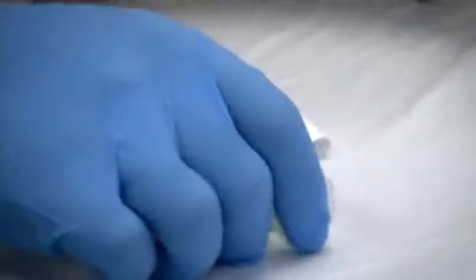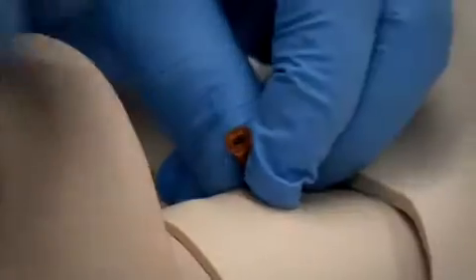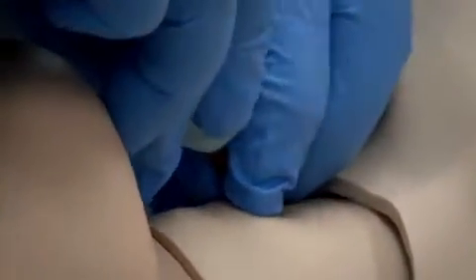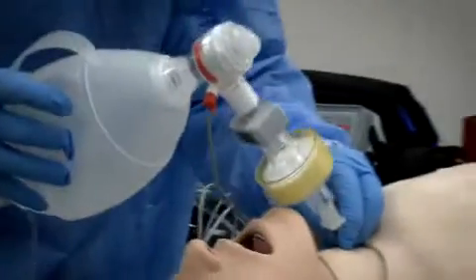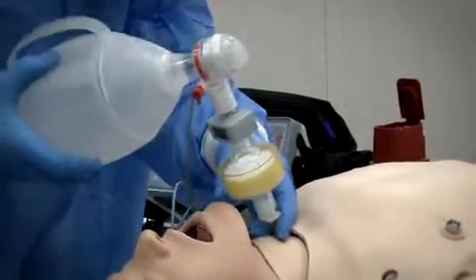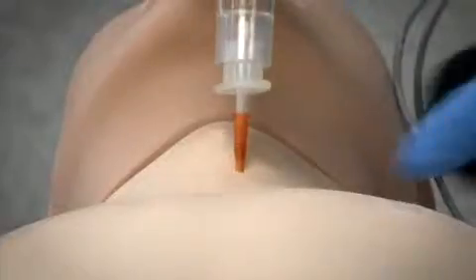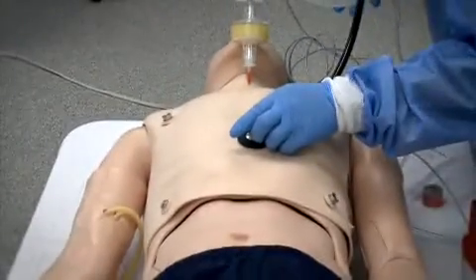Attach the 15 millimeter adapter that was removed from the ET tube to the hub of the catheter. Attach the BVM to the ET adapter and evaluate for placement. This includes end-tidal CO2 numeric reading with a 4-point waveform, equal air entry in all lung fields on auscultation, and visible chest rise when ventilated.